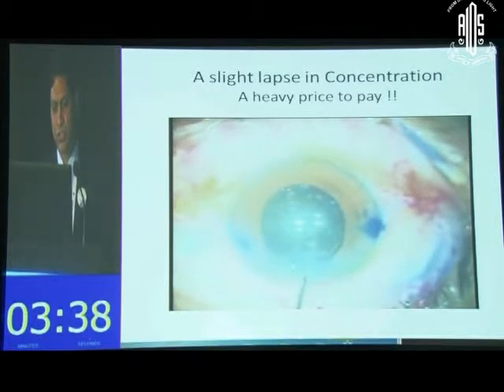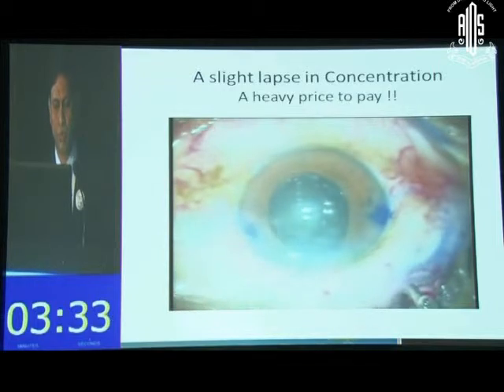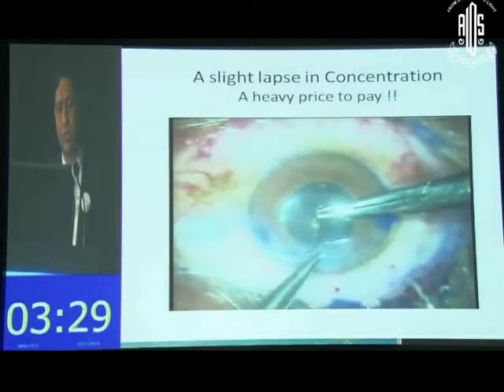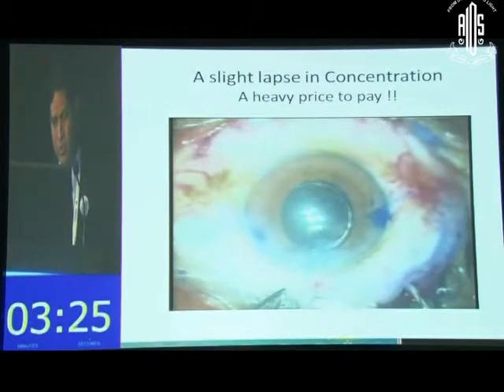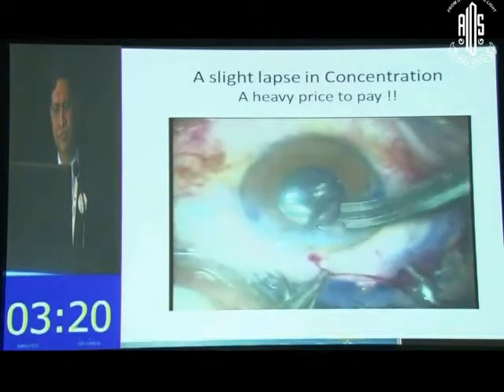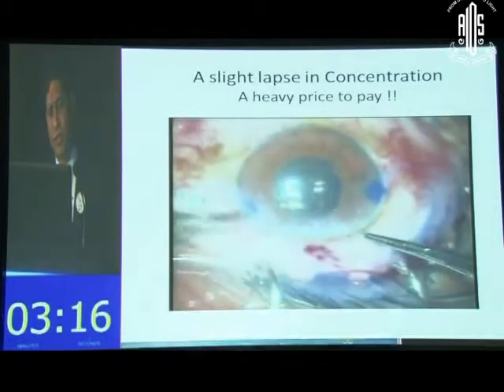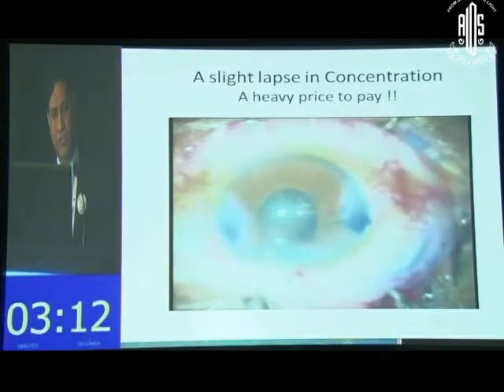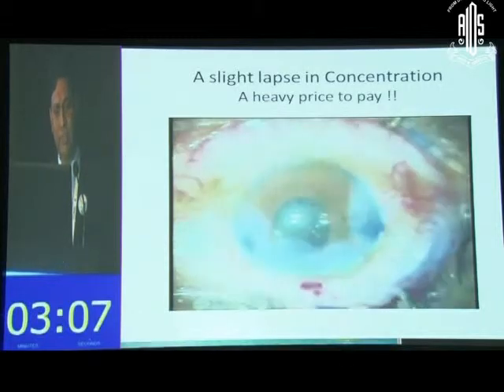See that? And so if you have a wound gape like that, you really have nothing else to do but put a couple of sutures. In fact, one suture is not going to really do the work over here, so you need two actually. I tried one, but I think I had decided way in advance that one would not do, so I had to put two sutures over here. And you see, I have a fairly clear cornea. This cornea was clear, so I had managed the nucleus very well, despite the adversities, but this particular cornea was a mess over there, and I had a bad astigmatism.